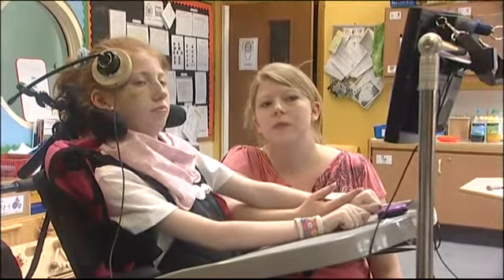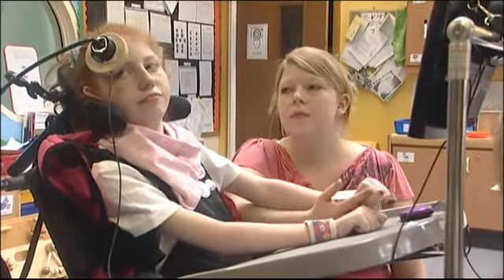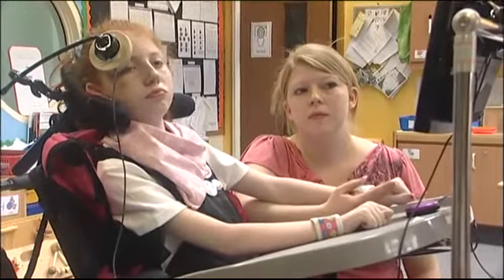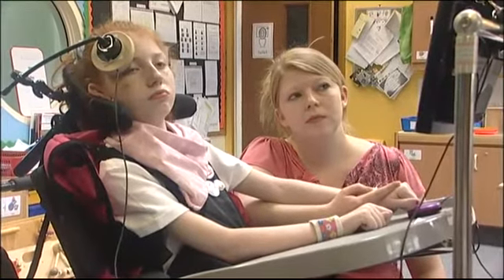She always has yes-no wristbands because when she was younger she was unable to control her movements, and that was the most reliable form of communication. She will eye point towards them, but also with her yes she tends to do a movement of the arm. Although she has now learned to shake her head, we tend to use her yes-no armbands because it makes it clearer to people who don't know her, so that if she is moving her arm and it has a yes symbol on it, they're more likely to understand that that is a form of communication rather than just an incidental movement. Could you find your friends page for me?